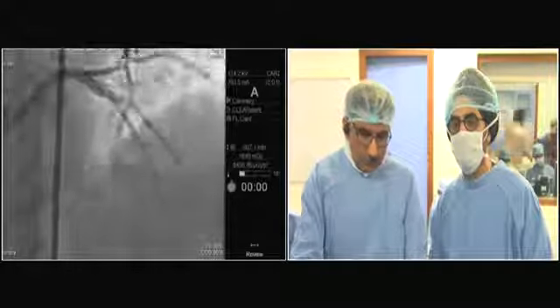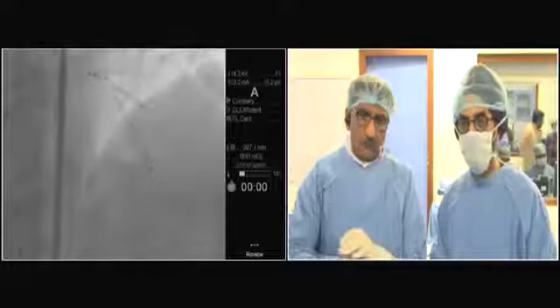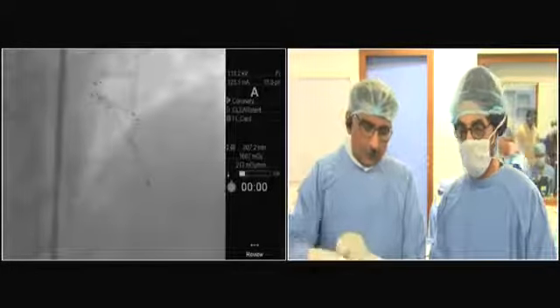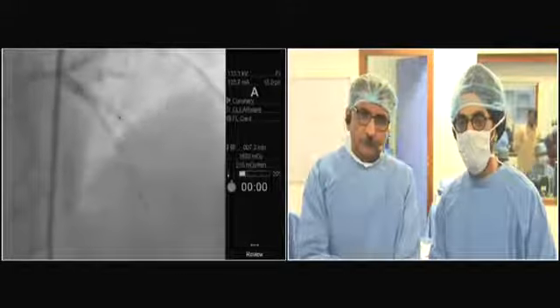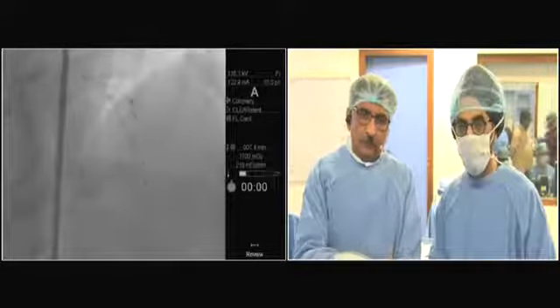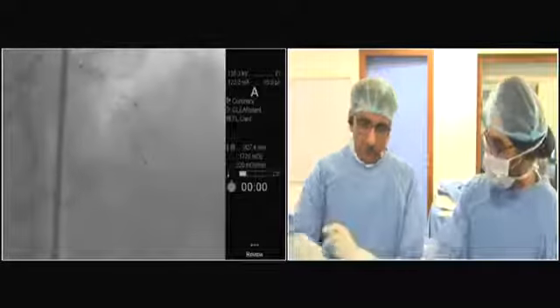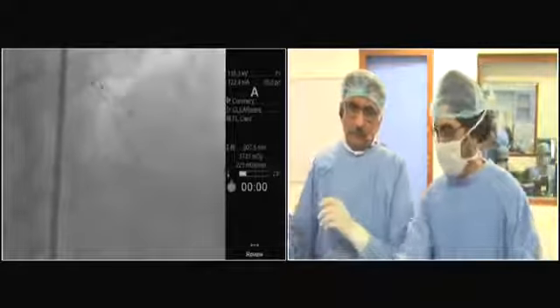I'm never doing double stenting beginning with the side branch. And when I have to do a double stenting, I know from the beginning that we'll have to implant the stent in the side branch after the main branch. And POT is, in this technique, absolutely essential because it opens completely the door toward the side branch. So if you do provisional, a POT is absolutely necessary for double stenting technique.